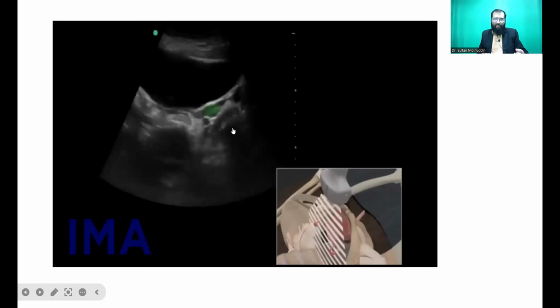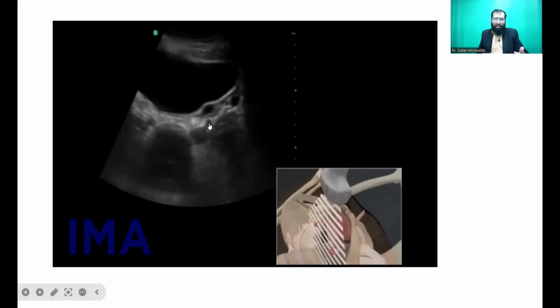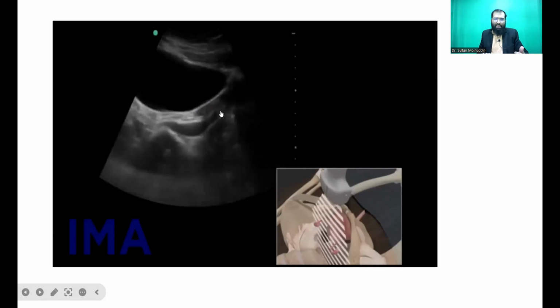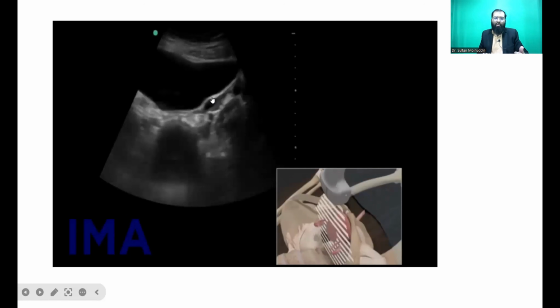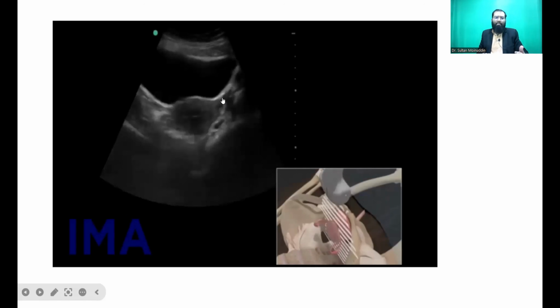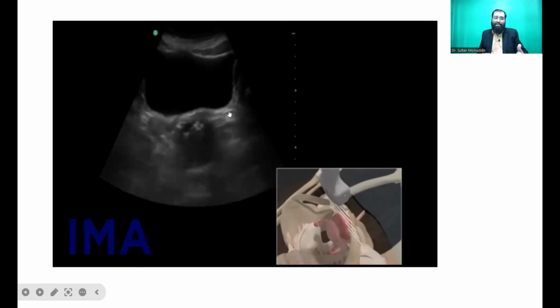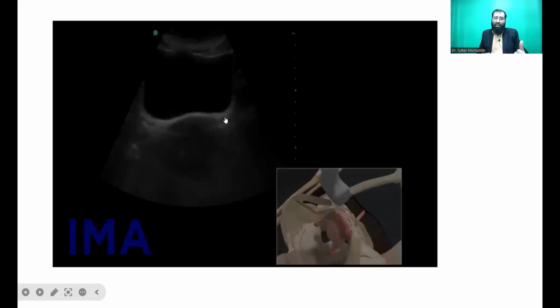Now this is the ovary on the left side. So this is the ovary on the opposite side, this one. Note very well that the iliac vessels lie posterior to this ovary. So if you trace the iliac vessels, you would easily be able to trace the ovary. Okay. So in young patients, it is easy to get the ovary, but in old patients or fat females, it becomes difficult to trace the ovary. So in all those patients, it is a very useful trick to trace the external iliac group of vessels. So go on tracing that, and then you would be able to see the ovary just anterior to it.